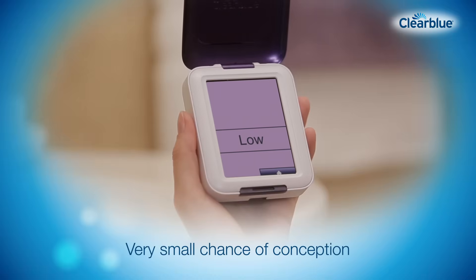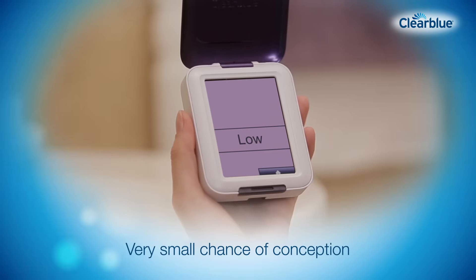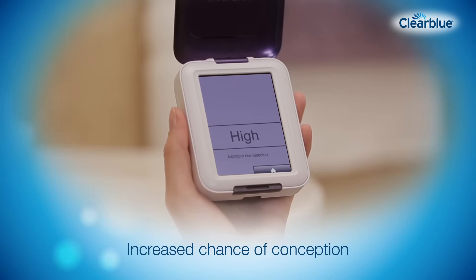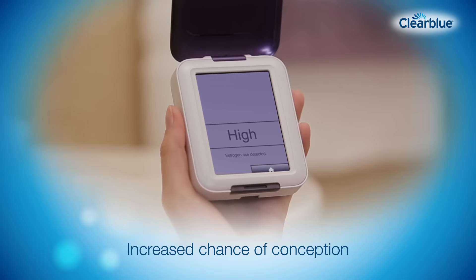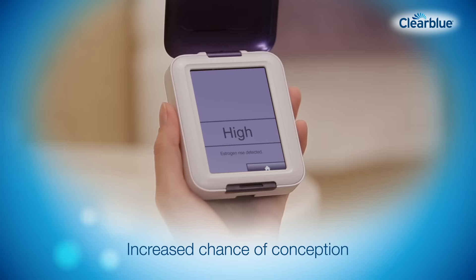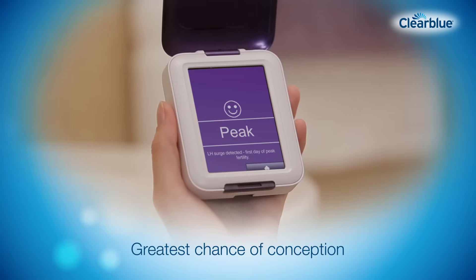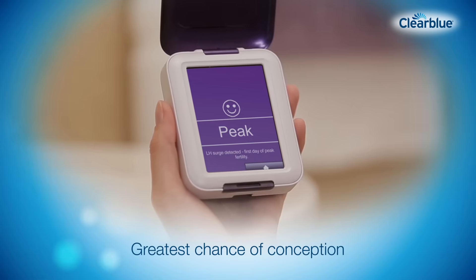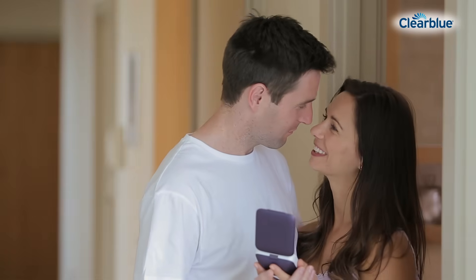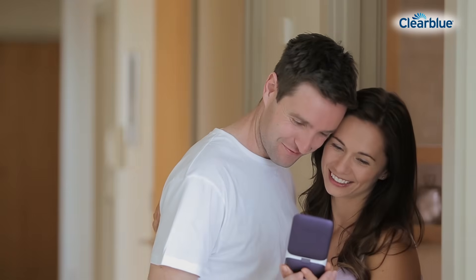Your fertility status will be displayed. If it's low, it's unlikely but not impossible that you will conceive if you have sex today. If it's high, you are approaching your peak fertility and have an increased chance of conception if you have sex on high fertility days. If you have sex whilst peak is displayed, you have the greatest chance of conception. Having sex on high and peak days maximizes your chances of getting pregnant.